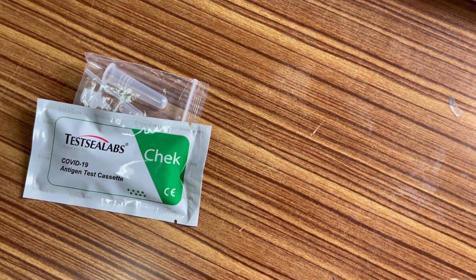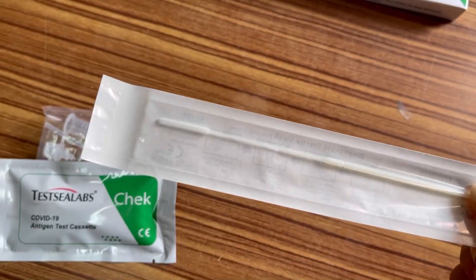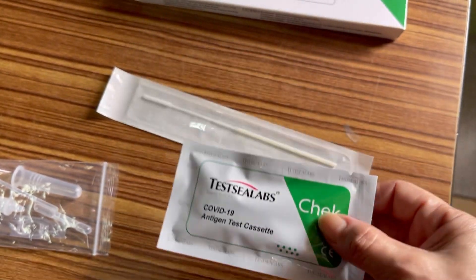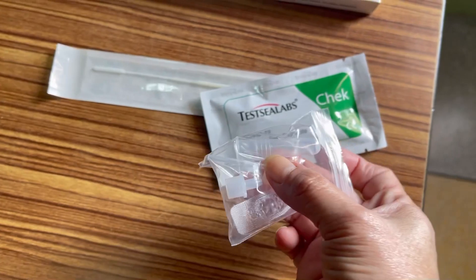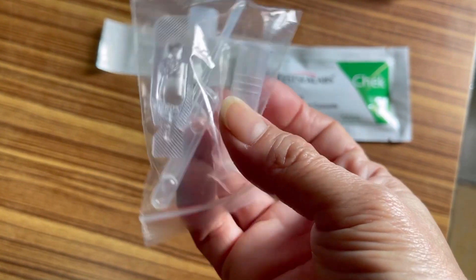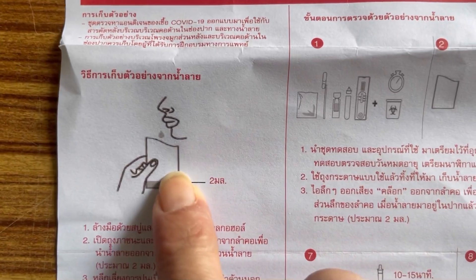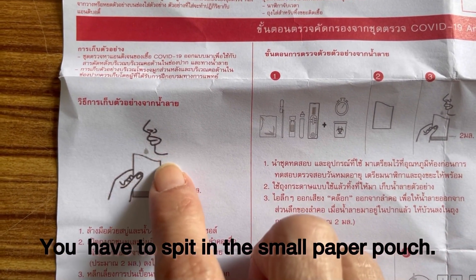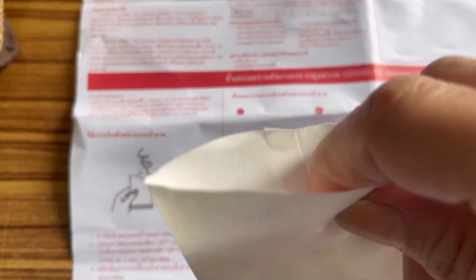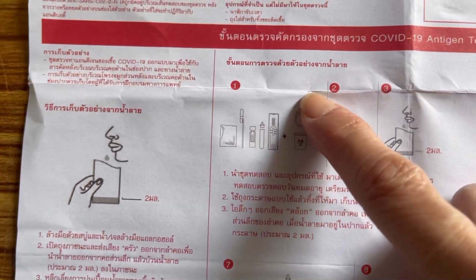If you want to check nasal, you collect the specimen from your nose, then you need the antigen test cassette. For saliva, all you need is the tube. According to the illustration, if you want to check your saliva, you have to spit into this paper pouch — you need at least 2 ml of saliva.